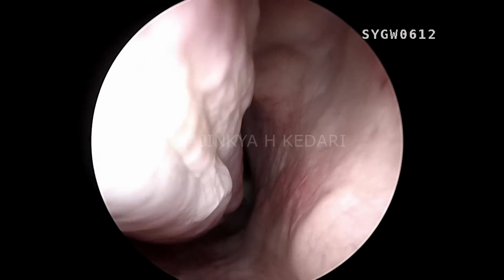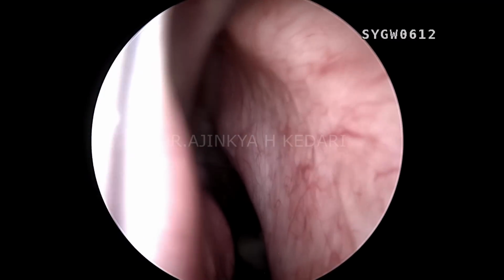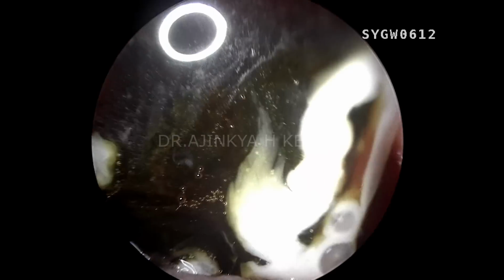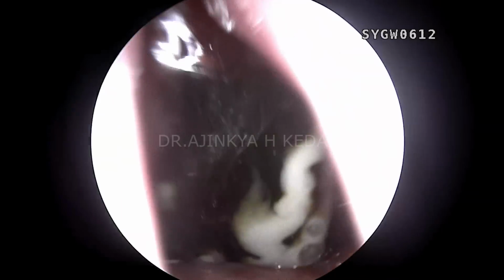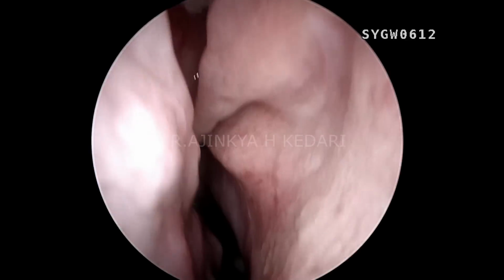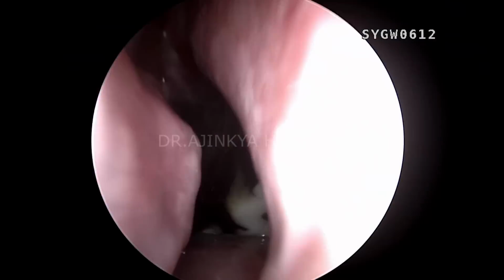You can see that's the inferior turbinate at your 9 o'clock, going way beyond, that's the choana. You can already see there's some kind of a deviation a little higher up in the posterior nasopharynx area. Hence my scope is not able to go. So I have to go down, and there you can see that's the choana area, that's the nasopharynx, and you can see a huge blood clot over there. So I'm going above and below, trying to show the area of the posterior nasal cavity.